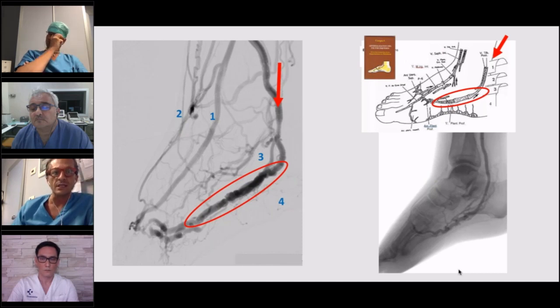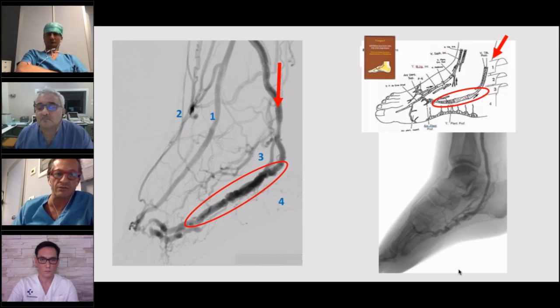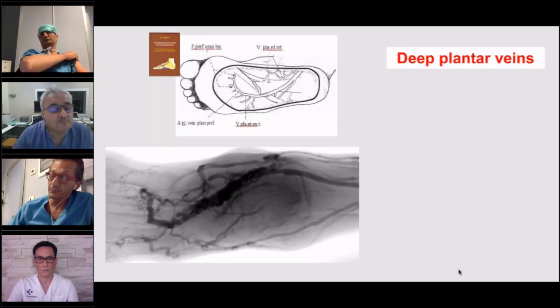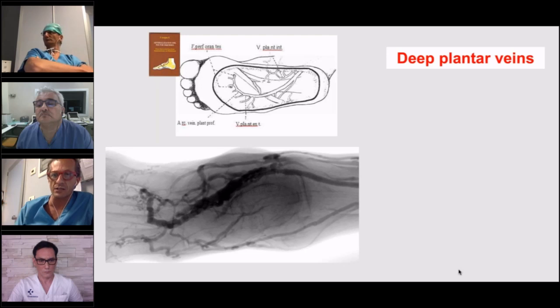The other well developed level, the superficial dorsal, constitutes the great saphenous vein, which is too far from any artery to be connected percutaneously. This is the reason why our connection usually is at the level of the tibioperoneal trunk, or at the proximal level of the peroneal or the posterior tibial artery. Then we arrive with the flow into the foot through the deep plantar vein.